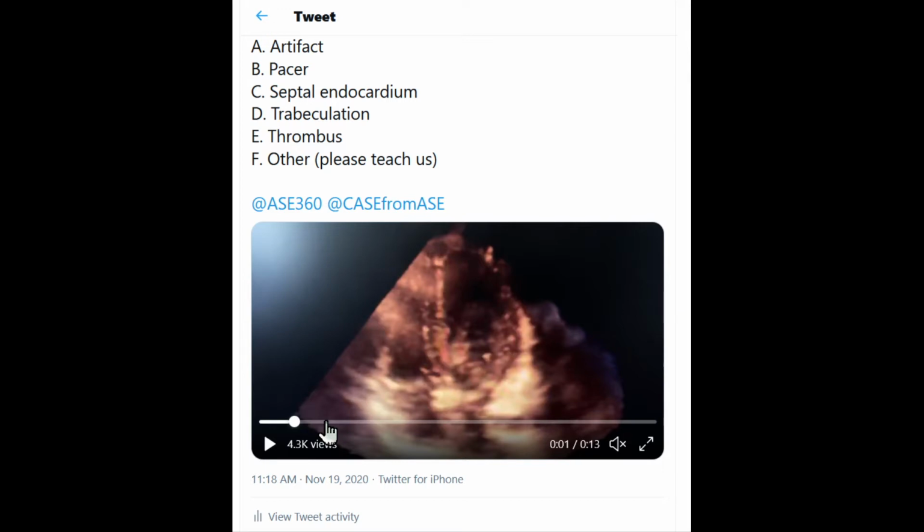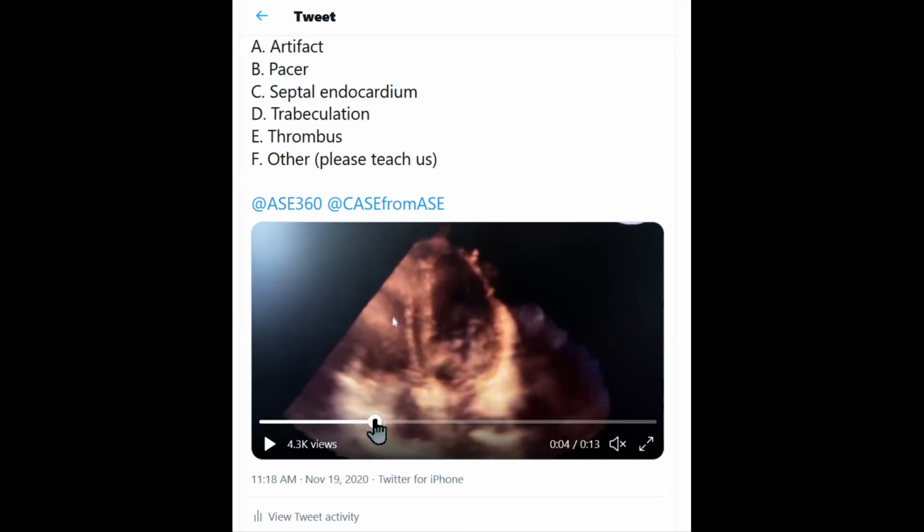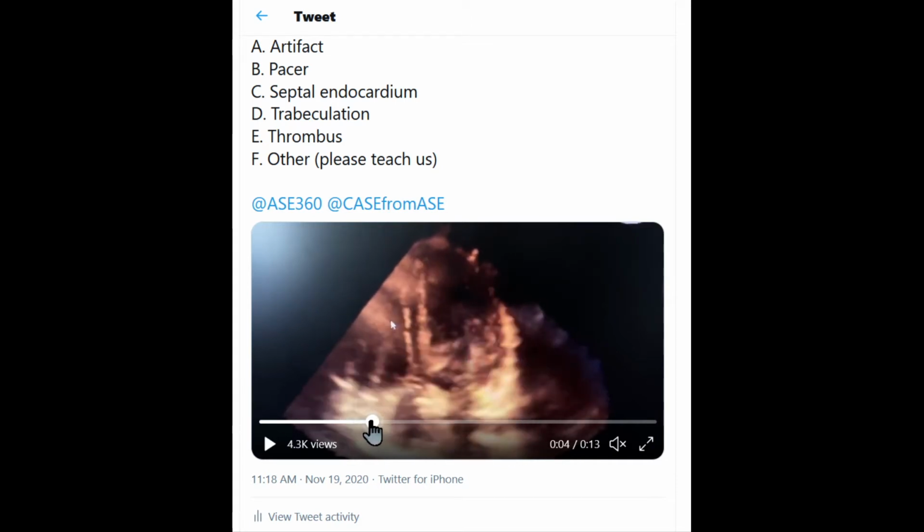If you look very carefully, you'll notice that in diastole versus in systole, that line is a little bit farther away from the septal line here. That's because this represents RV endocardium. Why it's brighter and seen better on 3D, I don't have a great explanation for. I'm sure it has to do with the signals created by the mid-myocardium versus the density of the signals from the endocardium. As this moves, it's thinner in diastole, and in systole it thickens. That just represents the normal septal thickening, as I just put it in slow motion there. You can sort of see that process.